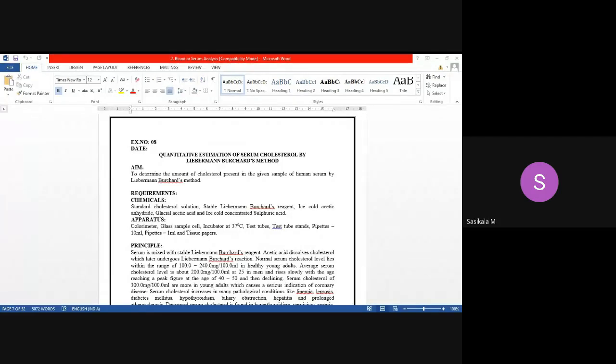Whole blood is taken directly, and that also will be stored with anticoagulant in order to avoid clot formation. And one more sample is with deproteination. We'll be removing proteins present in plasma by means of deproteinating agents like tungstic acid and trichloroacetic acid.